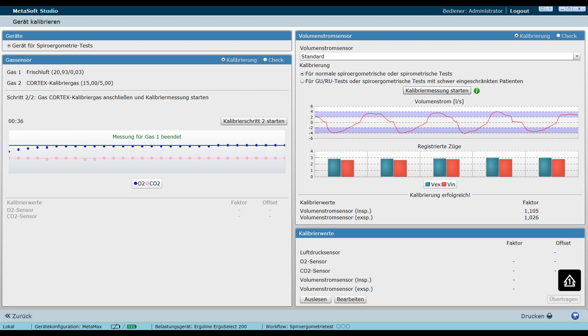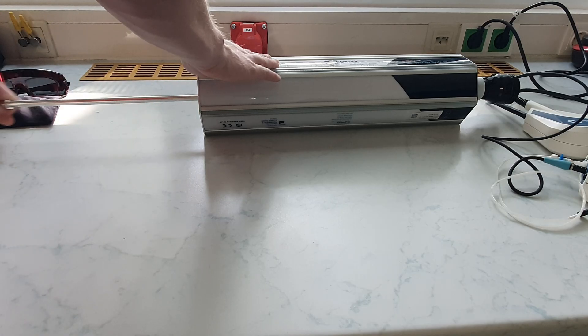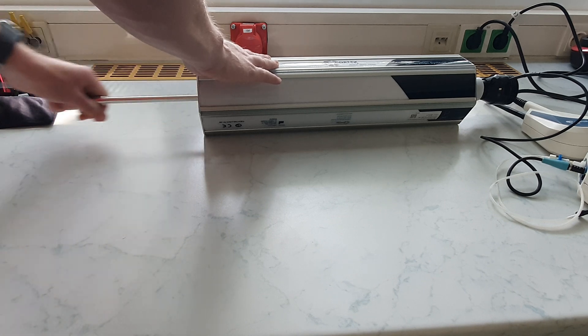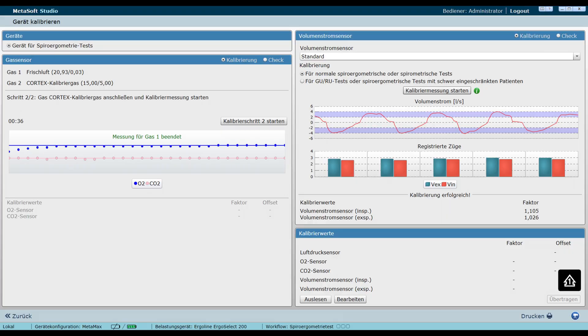After starting the measurement, pumping must be even. A red line appears on the screen that moves up and down with the pumping pulses. The program only counts pump pulses in the violet zone. Once the volume sensor calibration is complete, the gas sensor should be calibrated. This happens in the same window and is started by clicking on the start button. The calibration happens automatically, but make sure that there is no draft.